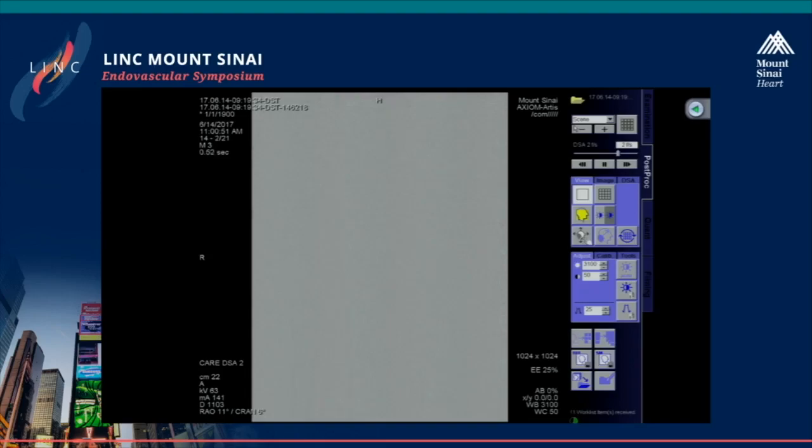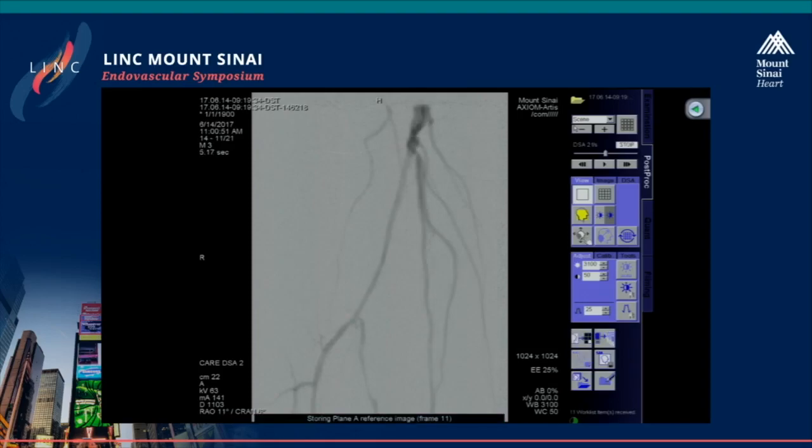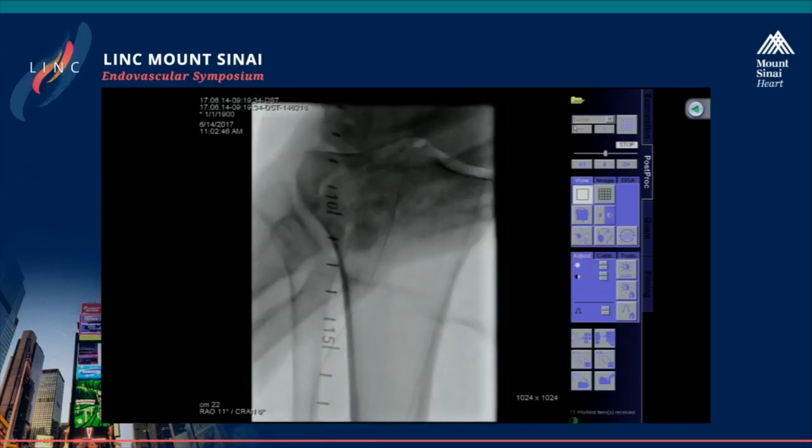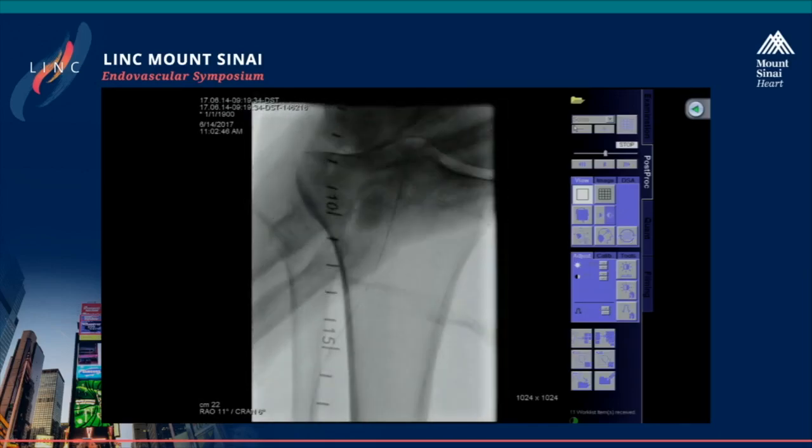So now what we're going to do is, because of our chronic renal insufficiency, I'm just going to save this next. We'll just move this over, and I think we're going to stop around 15 or so, and a little bit higher than that, and just do the straight segment with a Chocolate balloon.